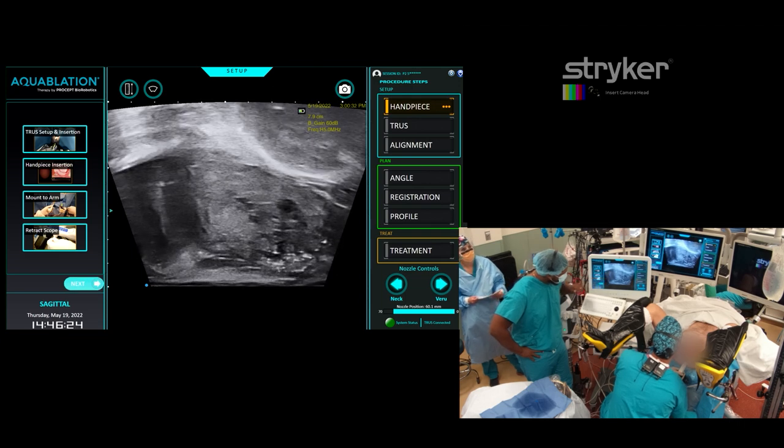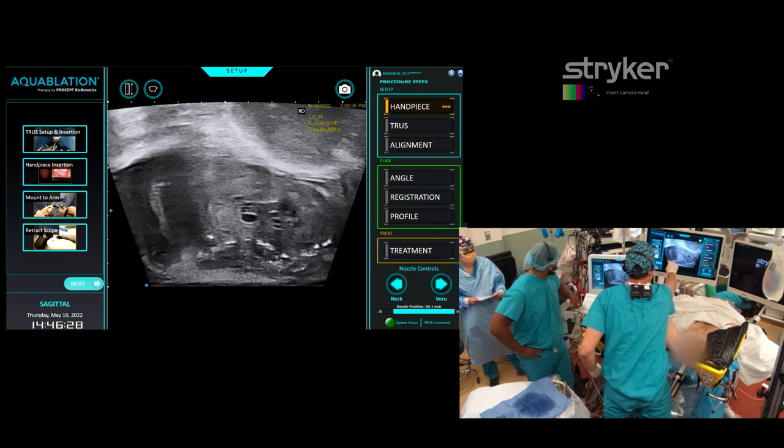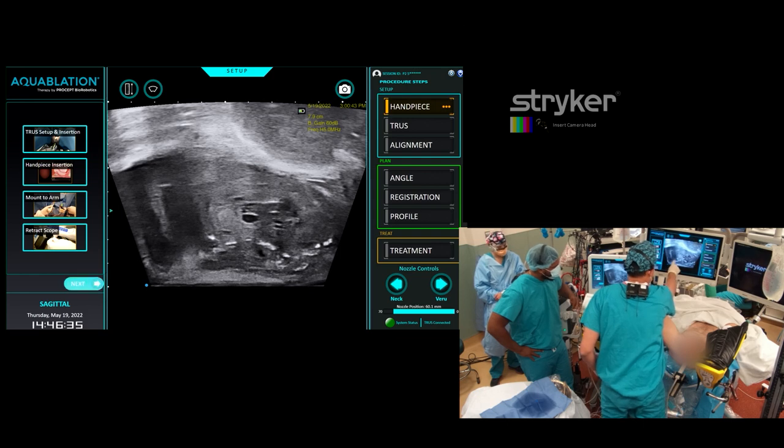It doesn't look that big, but you can see it right here. And there's a big median lobe here. Here's the bladder — that's all projecting into the bladder. Humongous. Bladder neck here.